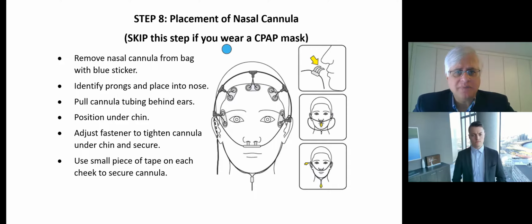Finally, we also show them how to place a nasal cannula. Now you'll note we don't have a thermistor in this device, which is perfectly fine. For our 1,000 or so recordings, we've acquired good quality signal with regards to the nasal cannula. So there is no thermistor, at least in this configuration of what we have.